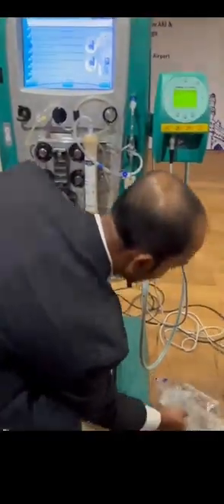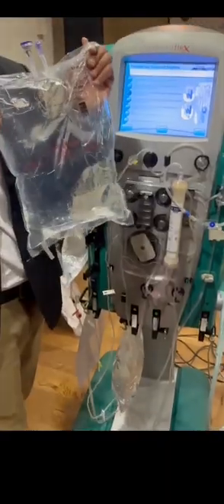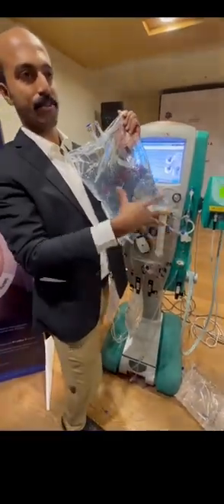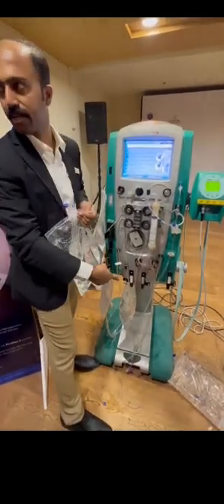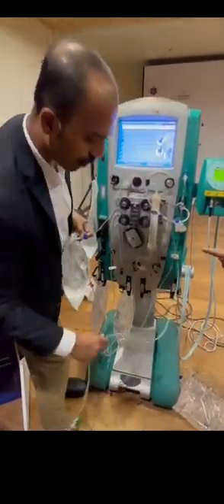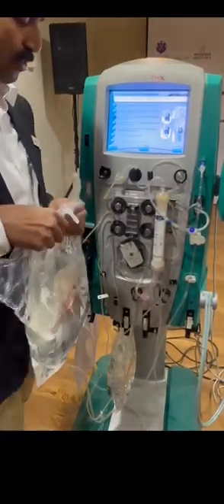Then along with the citrate, we use calcium-free dialysate. That is called Biphozyl, not Prismasol. The concentration is almost the same as Prismasol, but the calcium is 0 here. In Prismasol, it is 1.25 or 1.75. Because we are giving this citrate to chelate the calcium, if you give Prismasol, again that calcium will go into the circuit. It has got phosphate. Yes, phosphate. So I have connected the Biphozyl solution for the dialysate.